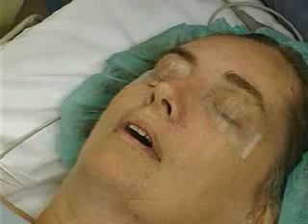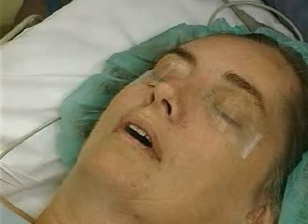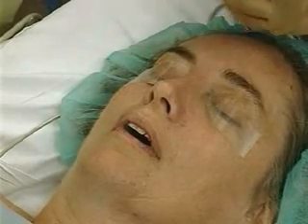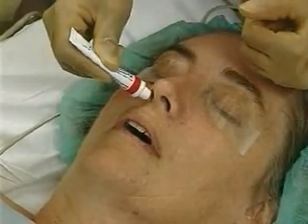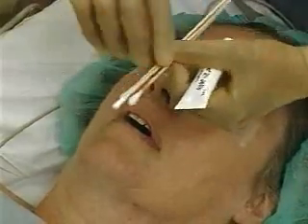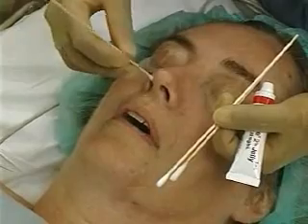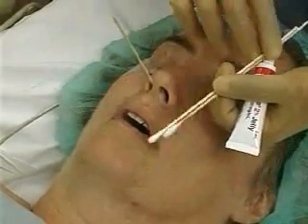Anesthesia is administered when placing the nasal airway device. The patency of the nares should be gauged by inspection and the mirror test for condensation. A topical slurry composed of 10 milligrams of phenylephrine in 10 milliliters of 2% lidocaine jelly is applied; this provides anesthesia and vasoconstriction of the nasal airway. The lidocaine jelly mixture is swabbed just inside the external edge of the nares until local anesthesia occurs.